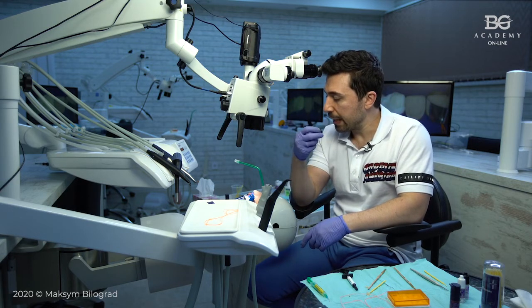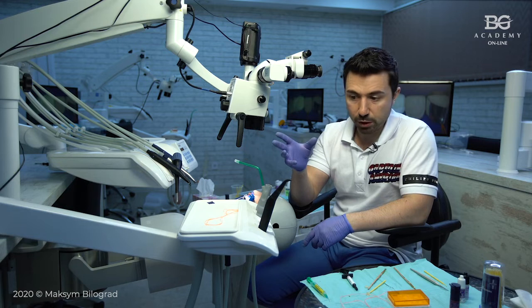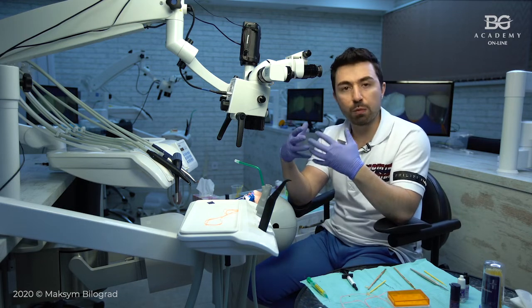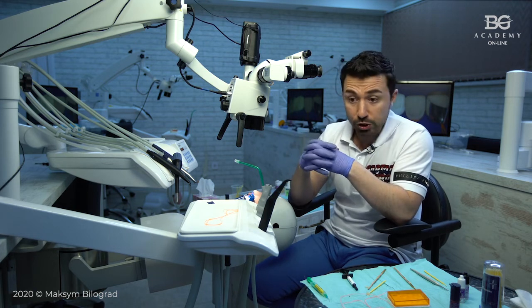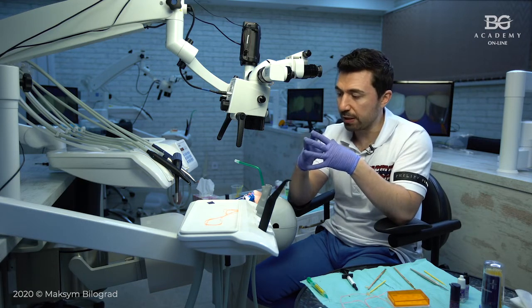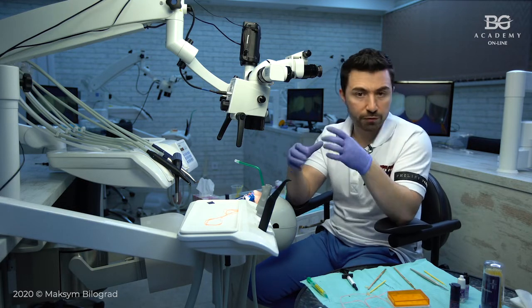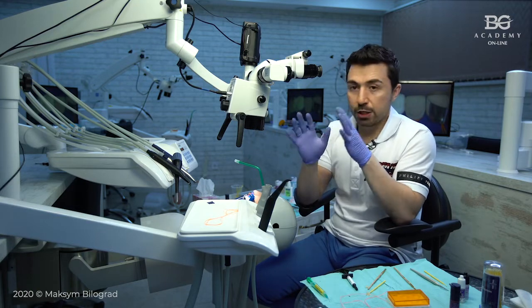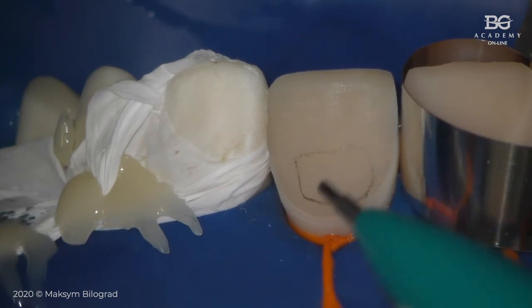What I would like to point out, okay, in this case, if you will use self-etch system, especially 7th generation of self-etching system, one bottle systems like multi-purpose, you have to be really careful when you are utilizing dual cure cements, because some dual cure cements are not compatible with this self-etching system. So if you are using dual cure resin cements for cementation, it's better to use bonding agent that is recommended by the manufacturer of this resin cement. Okay, so that was second scenario. Now we are going to the third scenario when we have enamel and we have filling. Let's pretend that this area is filling.